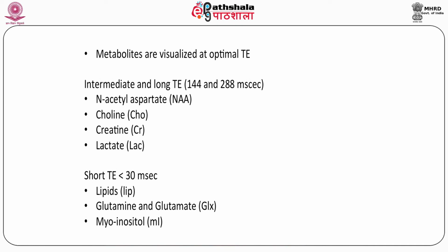Display of spectrum. This can be done in a graphical display, amplitude versus frequency, or a chemical shift imaging display, or a spectroscopic imaging display. Images of abundance of the certain metabolite can be picked up. Grayscale or color depiction of metabolites also can be seen.